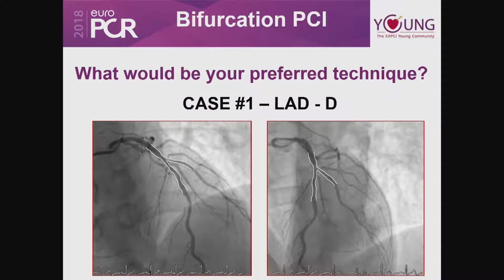But let's say in these projections, we at least see the distal and proximal reference diameter of the main branch. Angulation, as Diane just mentioned, if it's small angulation, it will be favorable for your procedure but worse for side branch patency. Is it smaller than 70 degrees?